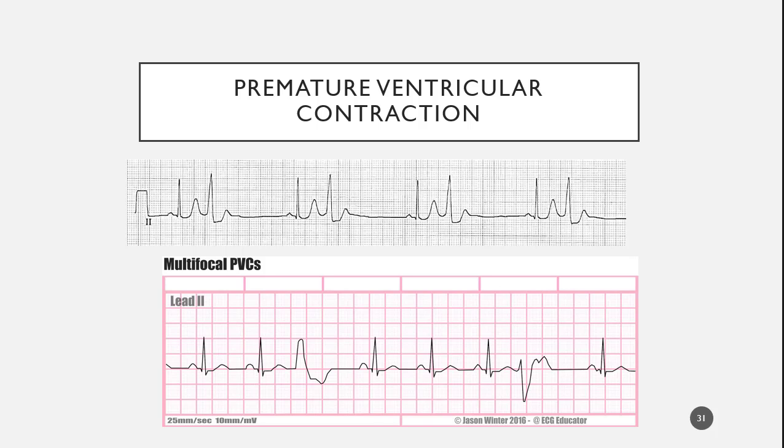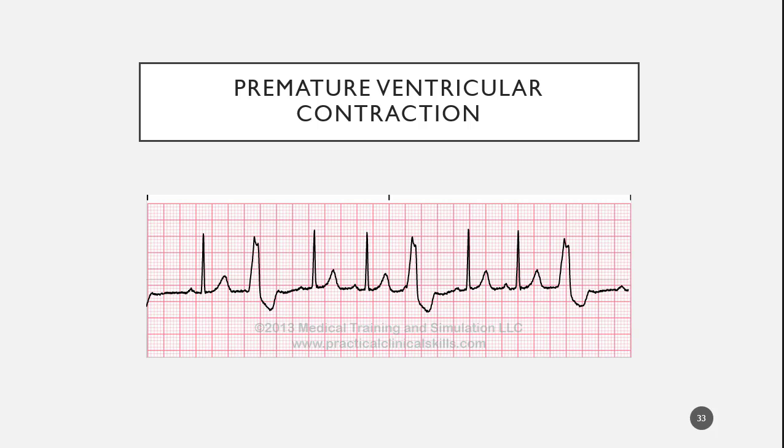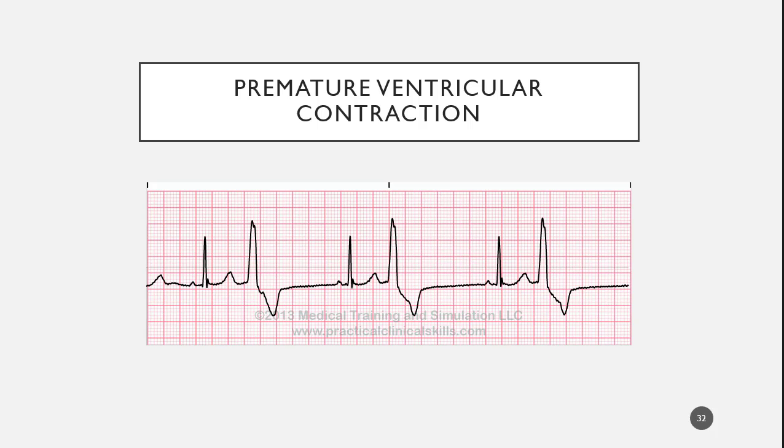and they're firing early. So again, with this one right here, we would identify this. You can call it ventricular bigeminy, but I want you to tell me, and you can say PVCs are unifocal, PVCs are multifocal. You don't have to tell me how many are in the strip. You just have to name it. Now, when we get into talking about cardiac disease, that's going to come into play. That's going to be important because the more PVCs the patient has, the more irritable the heart is and the more concern that we have.